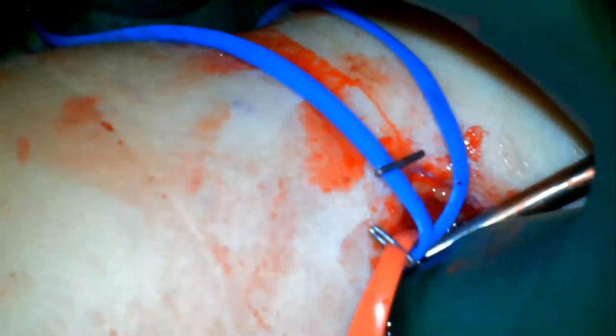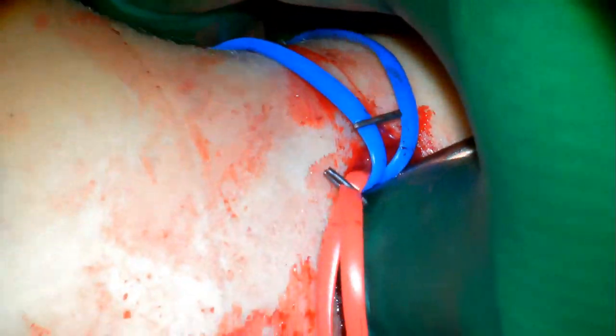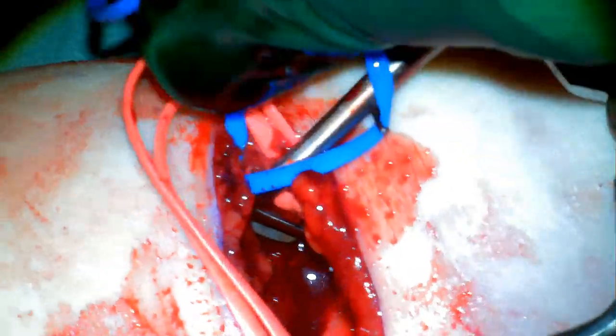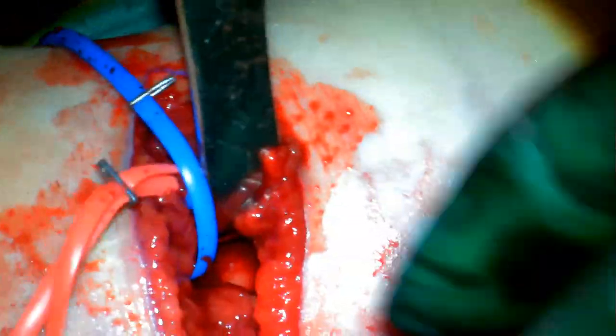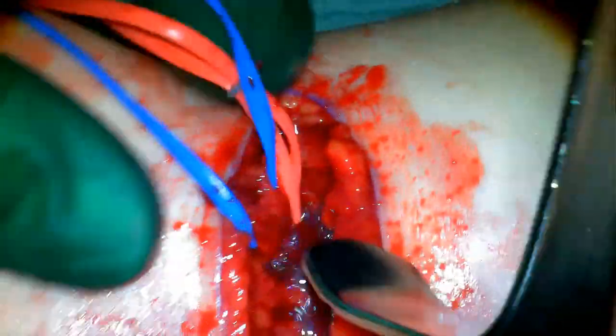With the surgeon's thumb, the fragment is pushed down and into its sleeve, and with the other hand, the elbow is brought up and flexed, just like we would do during a closed reduction of a supracondylar humerus fracture. Before doing the final reduction maneuver, we're going to take one last check to make sure that the now liberated median nerve and brachial artery are up and out of the fracture site.